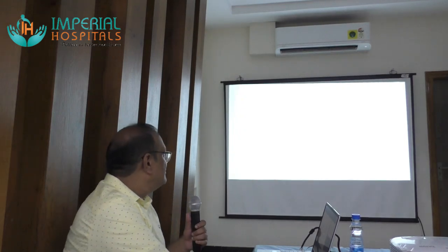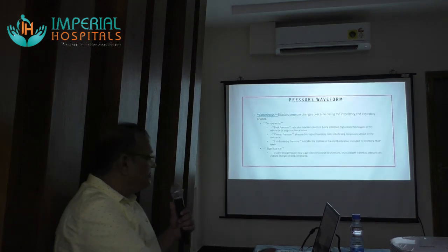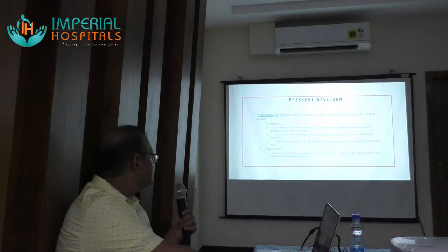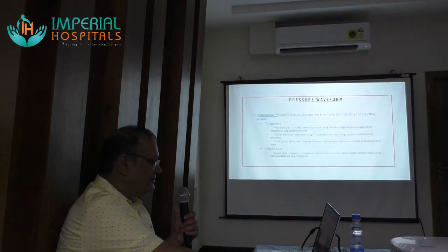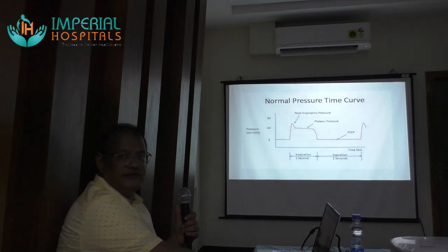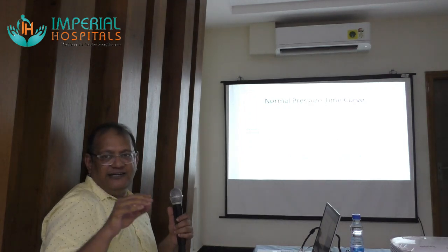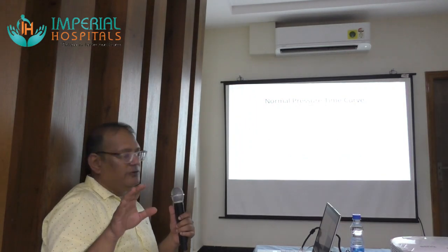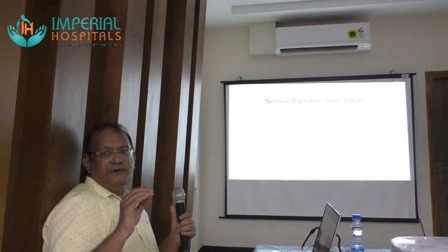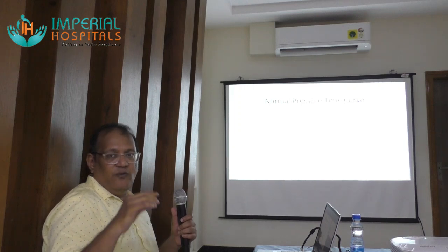So you'll see the following things here, right? The points you notice in the graph are peak pressure, plateau pressure, and expiratory pressure, right? These are the three things you'll notice here. So what is the peak pressure? This is the highest amount of pressure the ventilator has to apply to give the set tidal volume, right? This peak pressure matches the resistance of the airways, right?